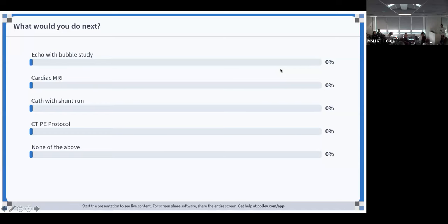And if I'm thinking from an adult standpoint and the views that are available, I'm looking at that 4-chamber. So do I see, I looked at the AV junction. Is that AV junction intact or not? Is that a primum ASD? I didn't see one. From that 4-chamber, if you sweep a bit posteriorly, you will see the coronary sinus. And if you don't see the coronary sinus, and you see something that looks like an ASD in the bottom part of the atrial septum, then you're thinking to yourself, is it a coronary sinus septal defect? And that can cause right atrial and right ventricular dilation, and it's easily missed.